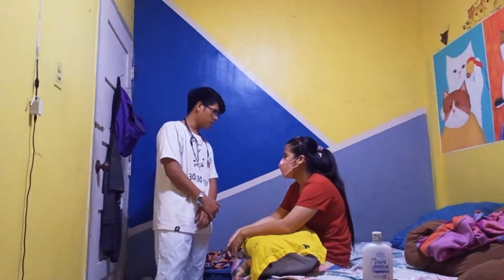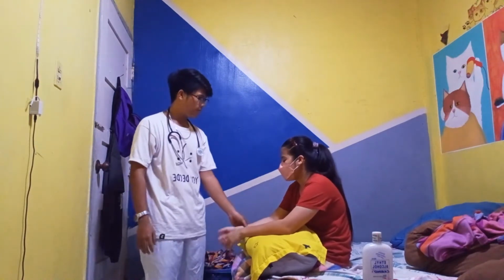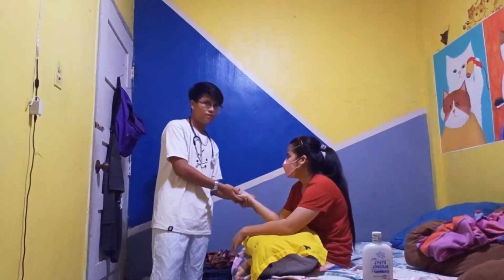So hi ma'am, good day. I am Al-sodaire, I am your nurse for today. So how are you ma'am? You're okay? So second is assess the client's condition or assess the client's skin if warm to touch. So to assess the signs of fever.